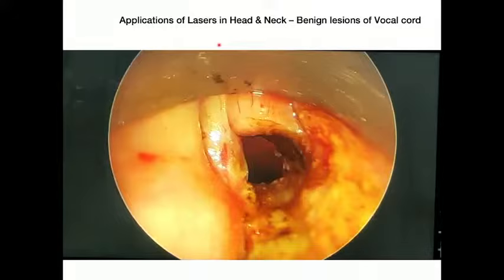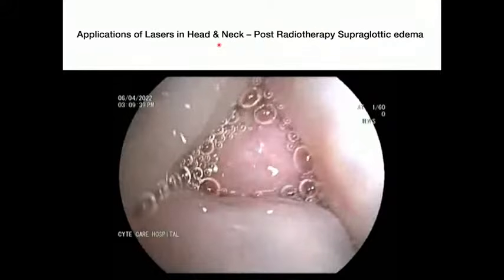Then you have to do an extensive resection of the posterior third of the vocal cord and the vocal process of the arytenoid. Okay, you may do a 100% resection, which on healing will give you roughly 20 to 30% of a gap. So if it's a fixed arytenoid, we do extensive cutting of the vocal process and the tissue of the vocal cord. And when you have a mobile vocal cord, you just cut the membranous vocal cord from the vocal process of the arytenoid right up to the thyroid, up to the cricoid, preserving the perichondrium. Thereby you get very good outcomes.